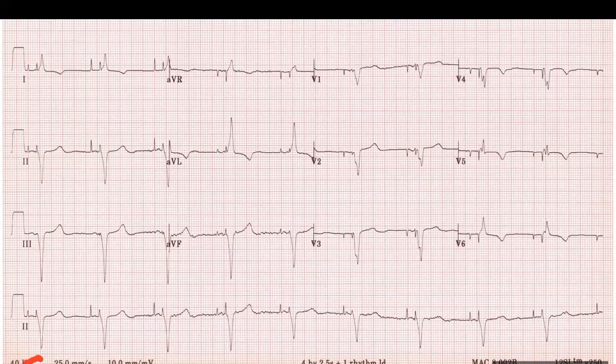So when you say functional, explain to me what you mean by functional. Functional meaning every P wave it is pacing, and QRS it is pacing also. So we talked about pacemaker function. There is good sensing and there is good capture, right? Yes.